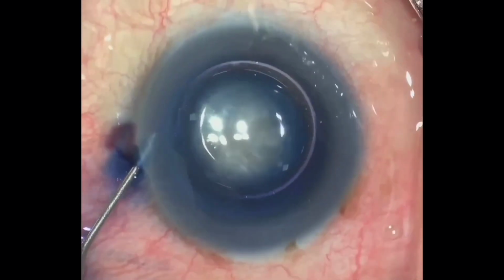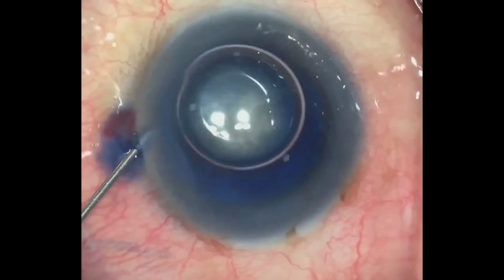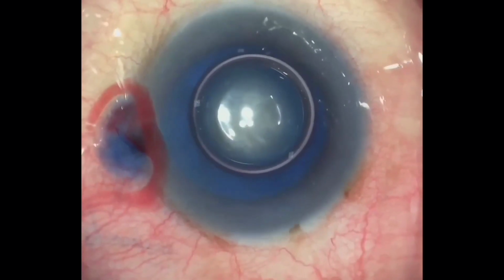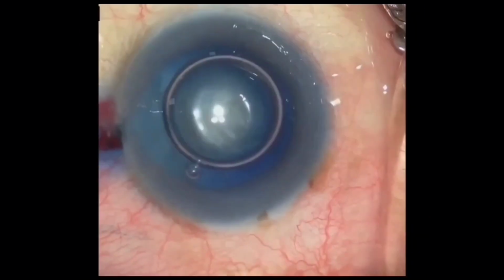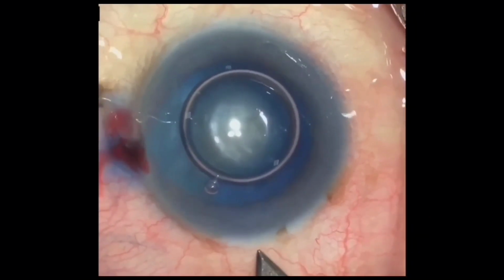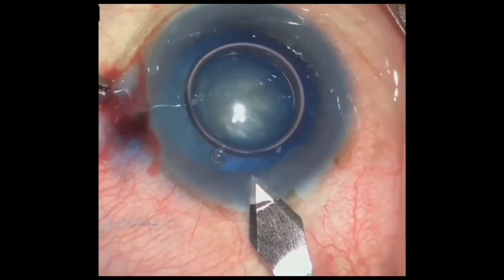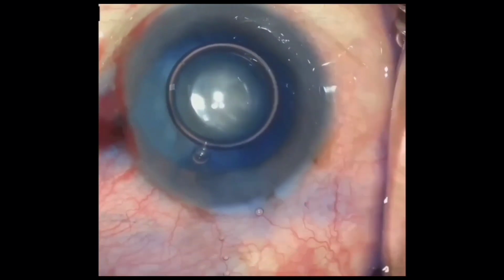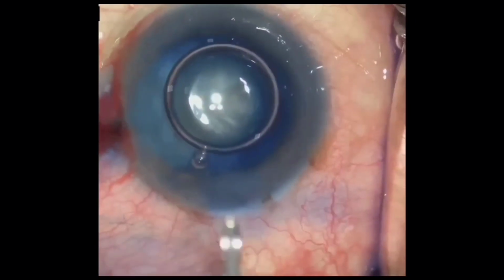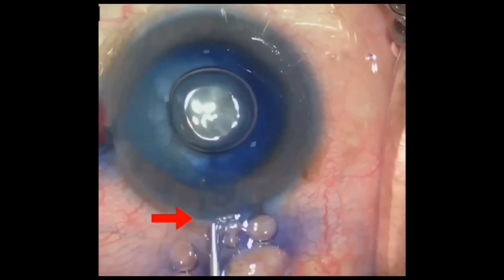After washing the anterior chamber of the excess trypan blue, viscoelastic was injected to maintain the anterior chamber space. A 2.8 mm clear corneal incision was made. On attempting to inject the viscoelastic, iris prolapse with outward escape of fluid from behind the iris was observed.